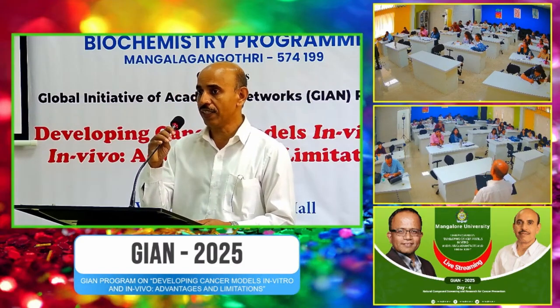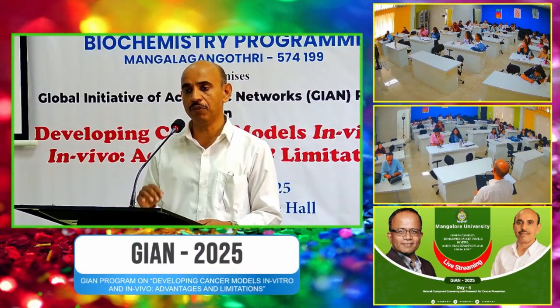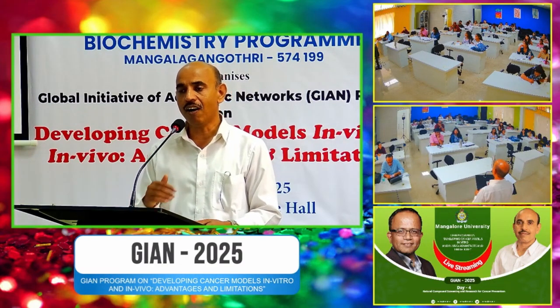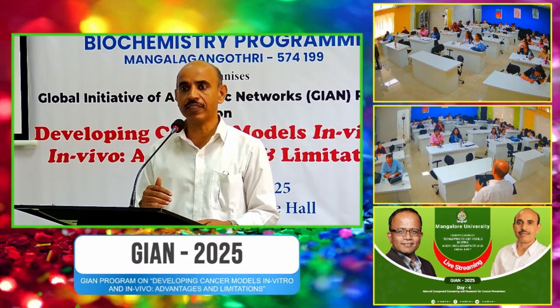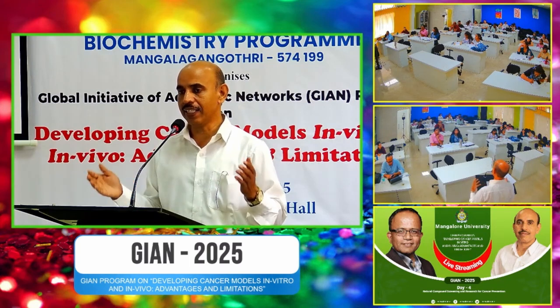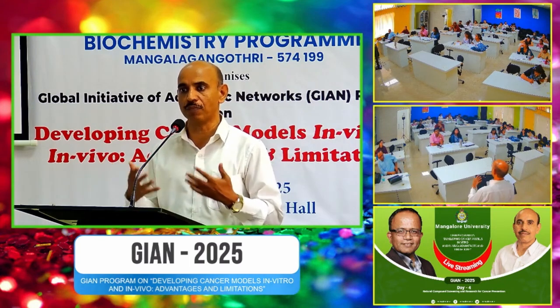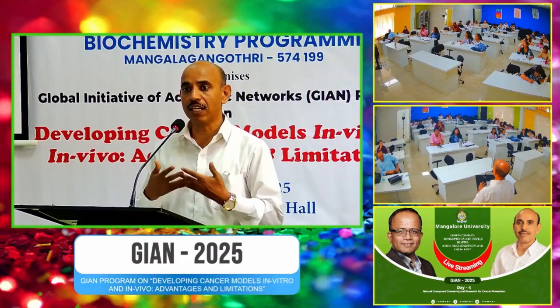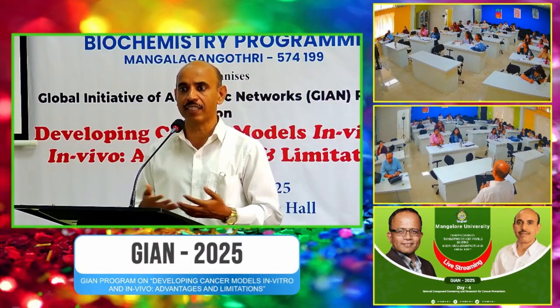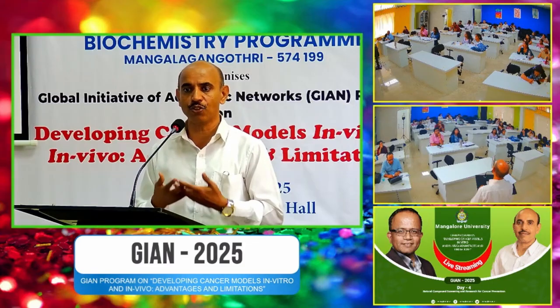The best way is to make sure that when you purchase the cells, you always purchase from a proper supplier. Authentic suppliers maintain something like the American Type Culture Collection discipline, and they mention that they follow this method to maintain the cell culture. That would be the best, because our regular source for cell culture is NCCS Pune.